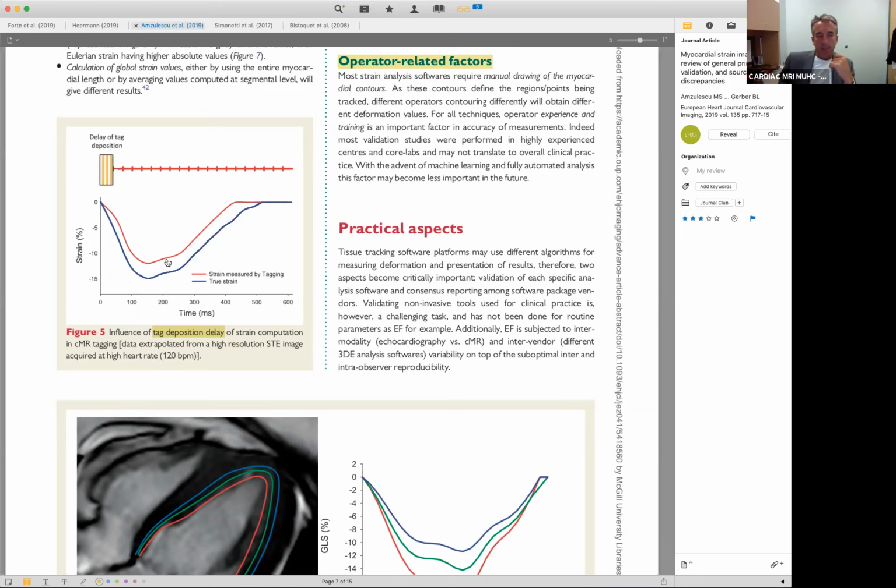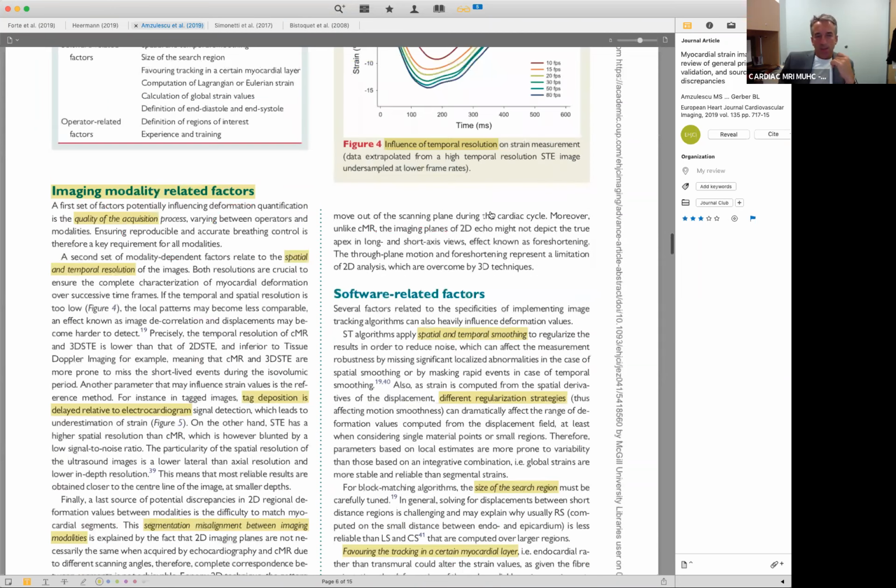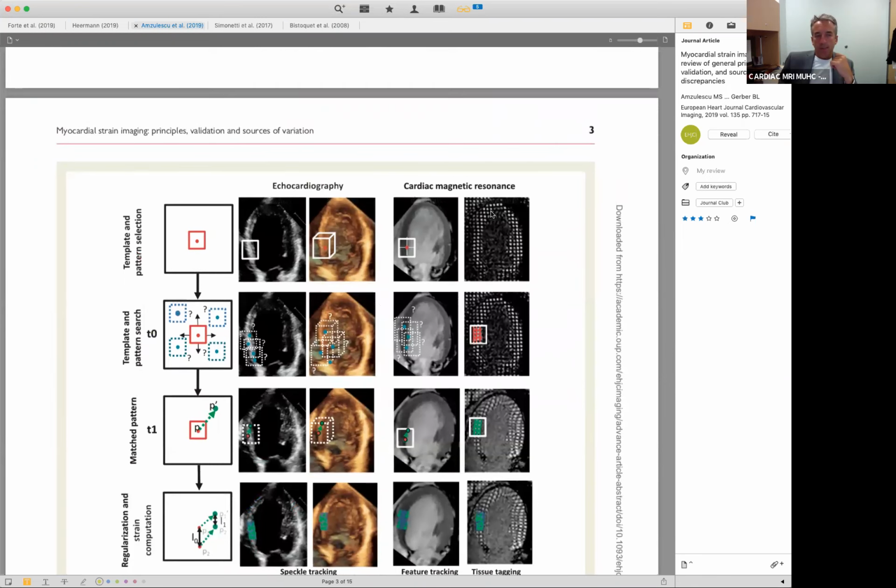Another limitation is that the spatial resolution is relatively limited. So in thin walls, you may have only one of these squares, and the thickness of these little saturation pulses, or the resulting signal intensity drop, is also relatively limiting in its way.